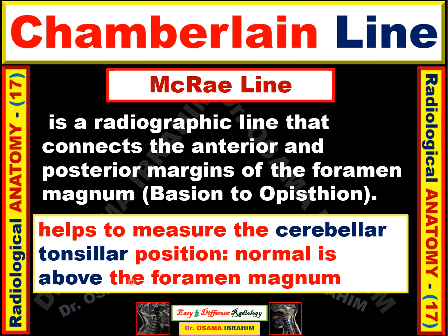Normal is above the foramen magnum. The cerebellar tonsils are normally above the foramen magnum or above this line. However, if they are detected below that line, we can consider it a grade of tonsillar herniation or Chiari malformation.